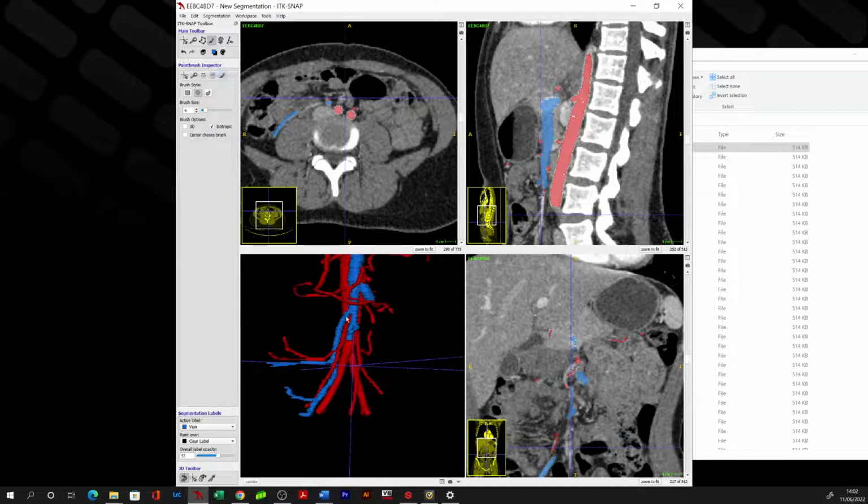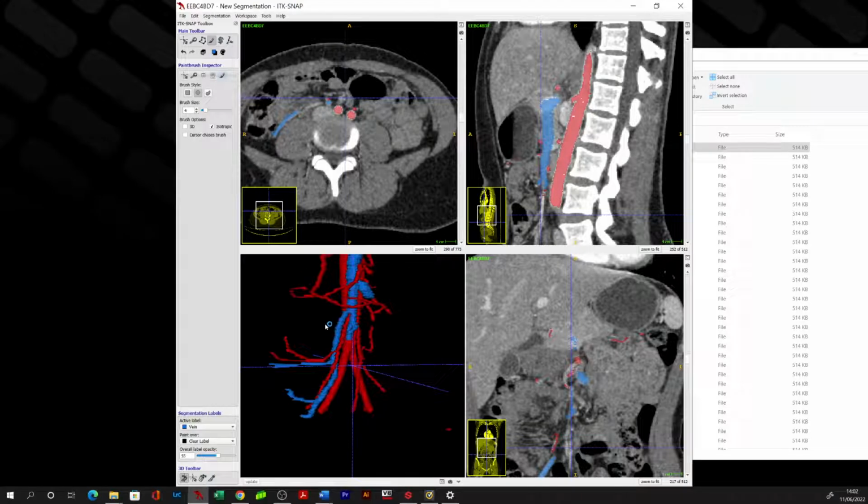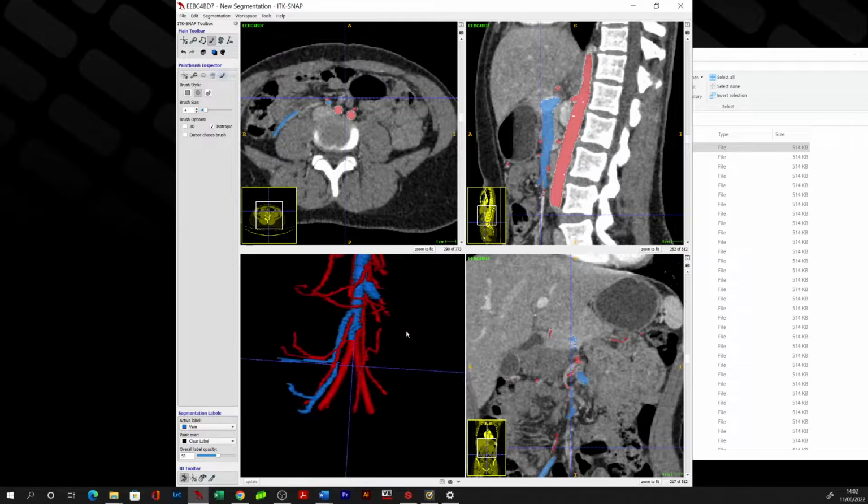Because the surgeons will be operating on the SMV, all this is largely irrelevant, other than the fact that it's useful for you to identify for your own learning, and also ensuring that you've identified the ileocolic vein, instead of misidentifying a right colic artery and vein and missing the ileocolic.